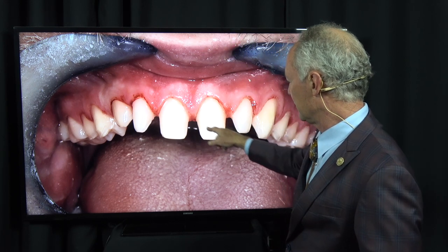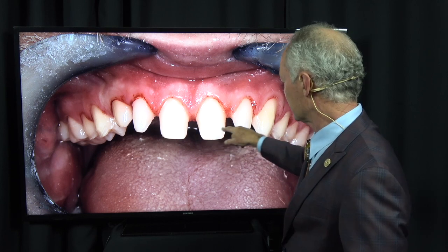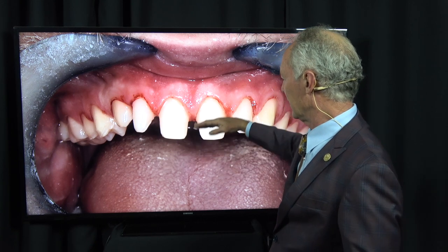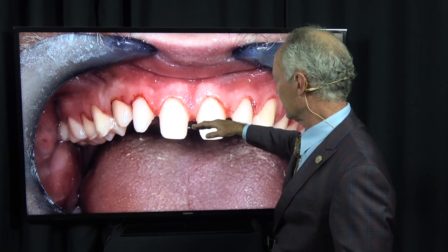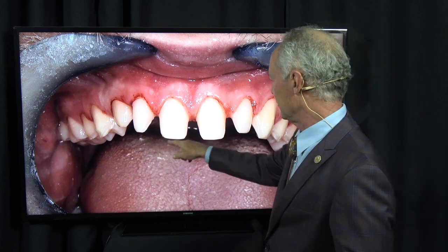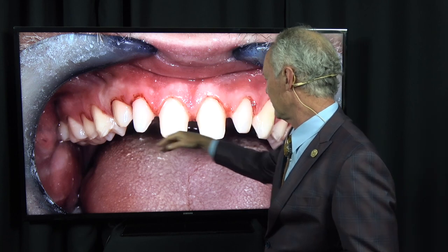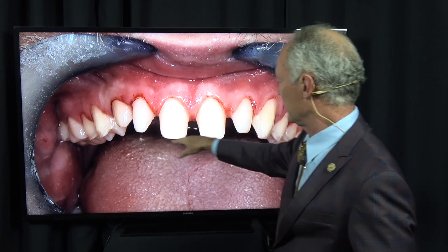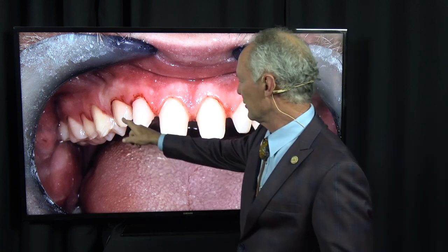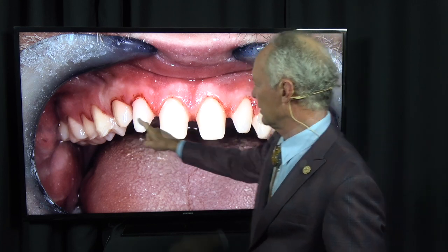Now, what if this tooth had a broken edge like this, or for some reason it was short down to here? Would you prepare this tooth down to that short incisal edge of the adjacent central? No. In that case, you would not. You'd just make this edge parallel to the pupillary line. See, this edge is flat, flat, flat. So once you get these edges, you try to coordinate the edges of the adjacent teeth, although this was a short cuspid, so I'm not going to shorten this cuspid to that cuspid.